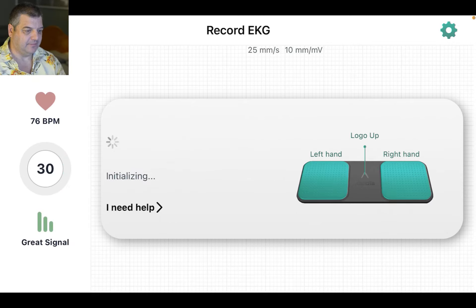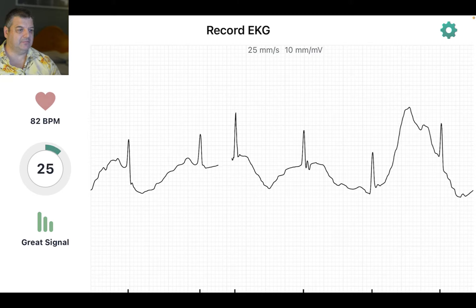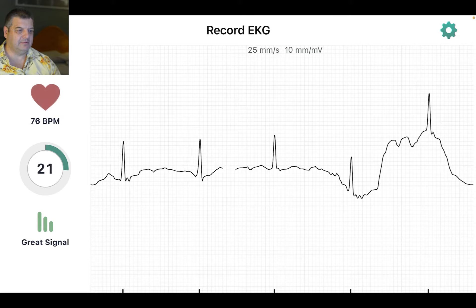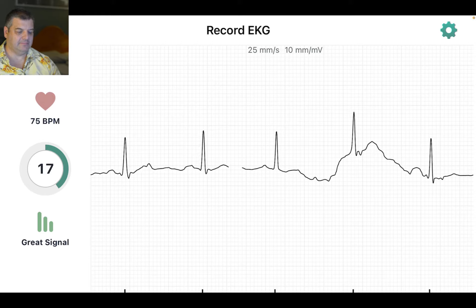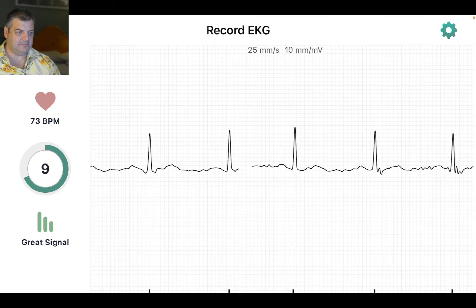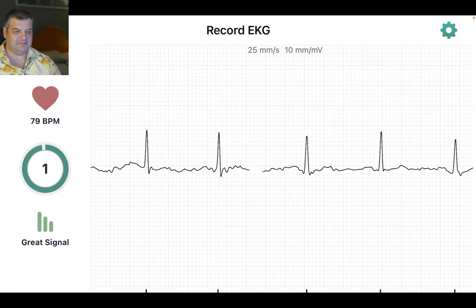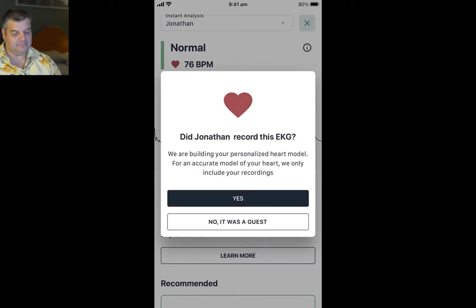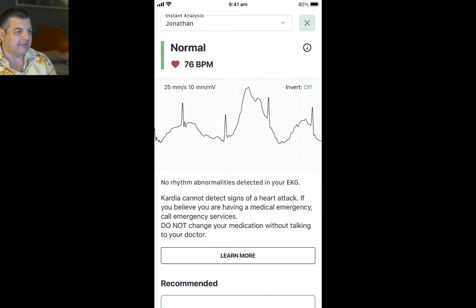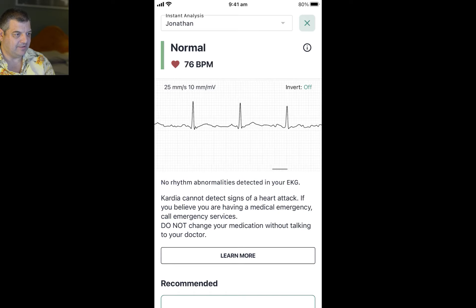Let's try it again. I'll try and keep away from everything, let's move it back a bit. It works better on a desk usually — usually I take it off my phone and put it on the desk. There we go, it's coming up normal. And it says 'Jonathan, is this you?' and I'll put yes. You can actually flick through the actual ECG here. This one's not a great recording, but it's settled down there.